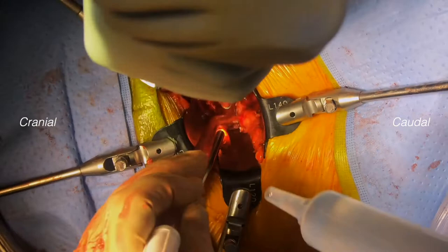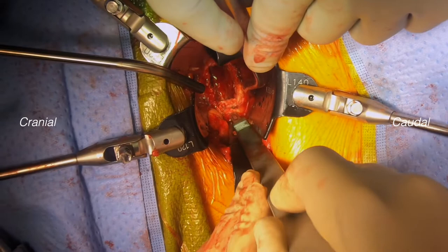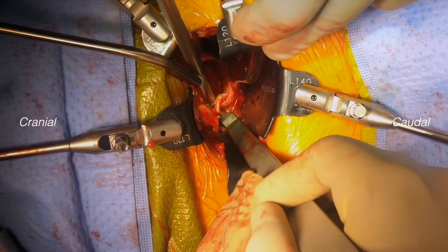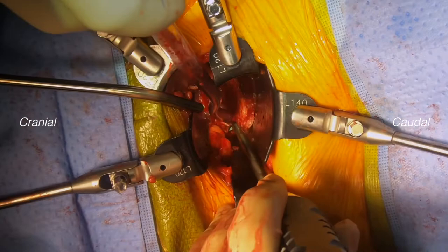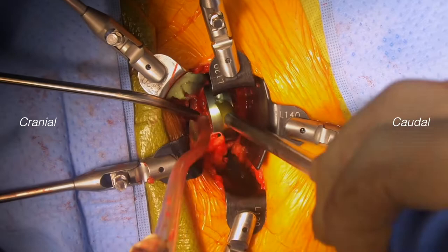After measuring against a trial, we increase the size of our anterior annulotomy. A trial spacer is then placed to identify size and fit.